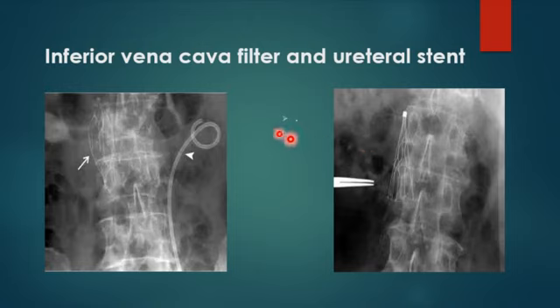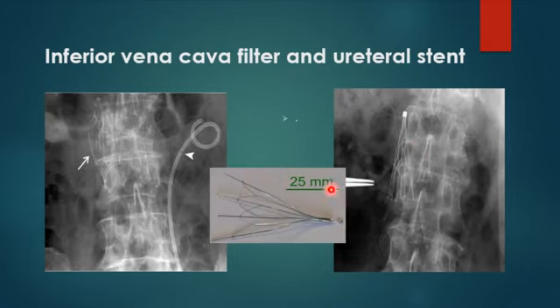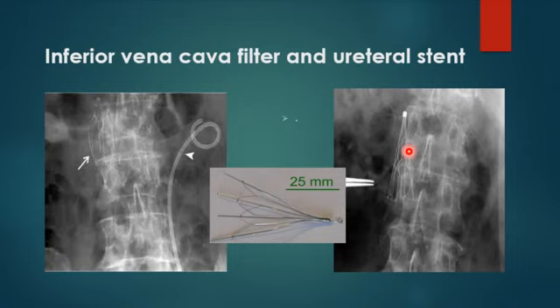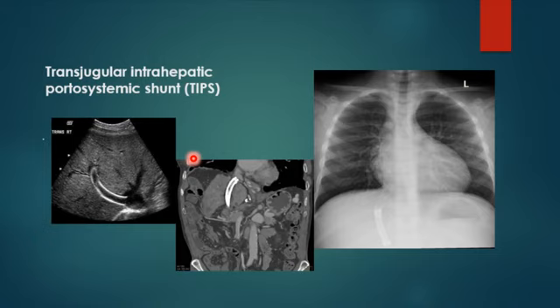An inferior vena cava filter is placed in patients with recurrent venous thrombosis. It looks like a fork on imaging, positioned in the IVC typically below the level of the renal veins, to prevent thrombus propagation. This patient also has a proximal venous stent visible.